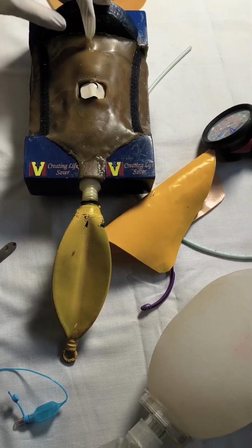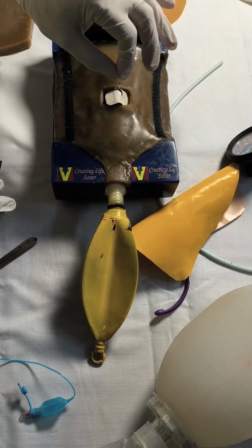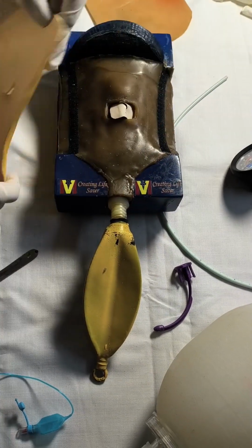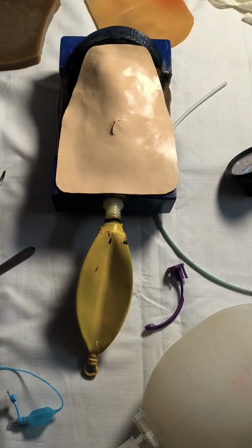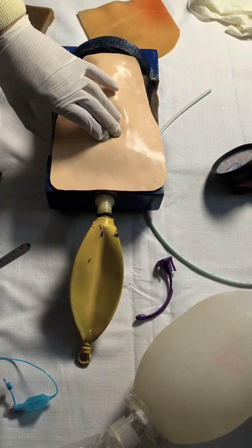So you have to just replace the cricothyroid membrane and the flap, and then you can just go. This is very economical, I would say, befitting Indian conditions, because we have been encountering the price issue, and hopefully this will solve that problem.